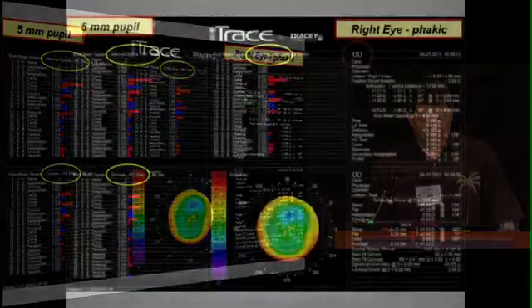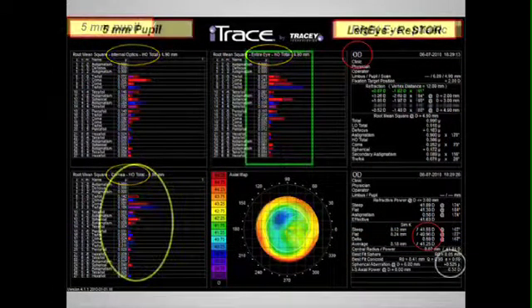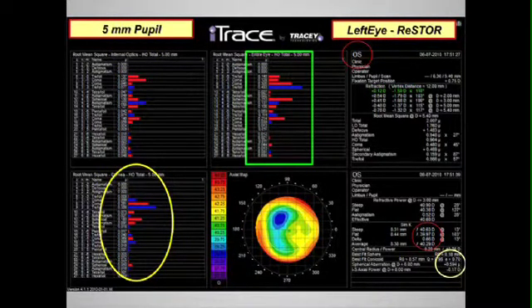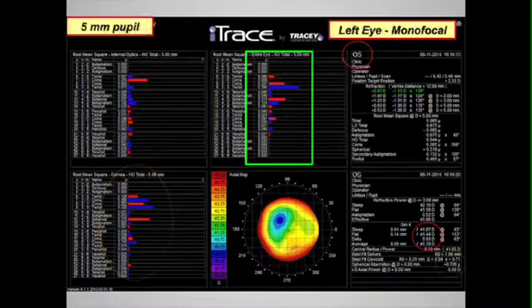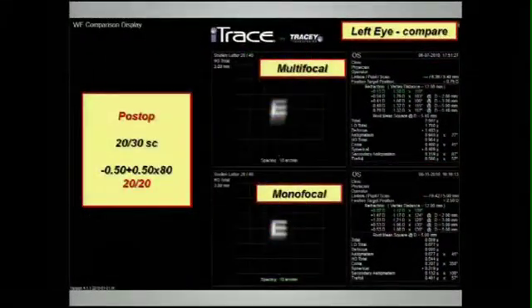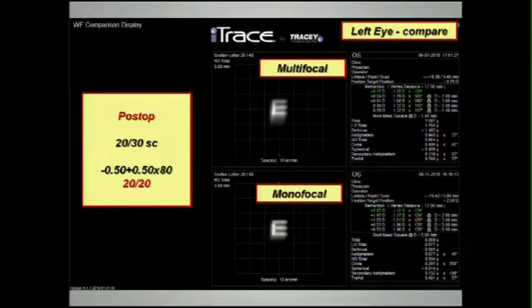Let's look at this. With a 5-millimeter pupil — this is the right eye, post-LASIK, so we see some aberrations. Then the left eye — I'm not an expert in reading topography, but this is not perfectly centered. What I like about this is it really quantifies it. Instead of just a gestalt of looking at topography, her trefoil and her coma is just off the map. These are the aberrations of the total eye. I ended up taking that lens out, and she was just dramatically happier afterwards with a monofocal. The lesson is this is before, and this is with a monofocal. She still has aberrations coming from the cornea — you can do a compare map — but there was a subjective improvement that was just dramatic.